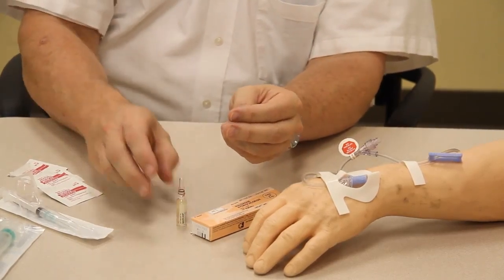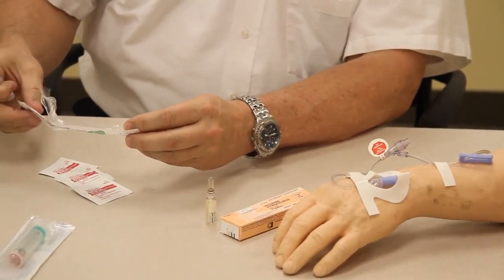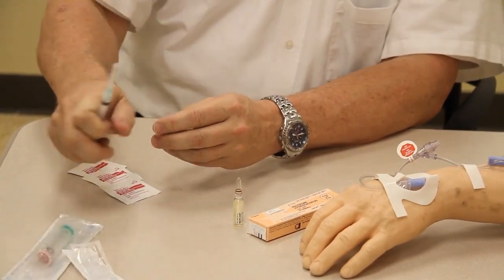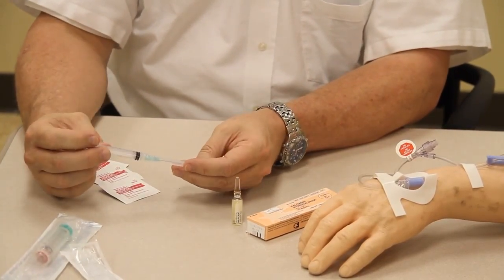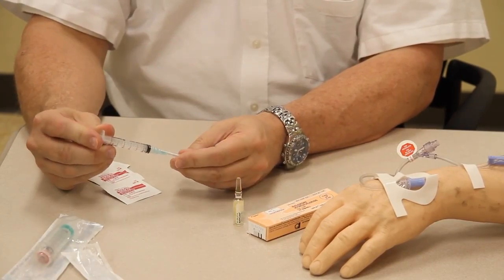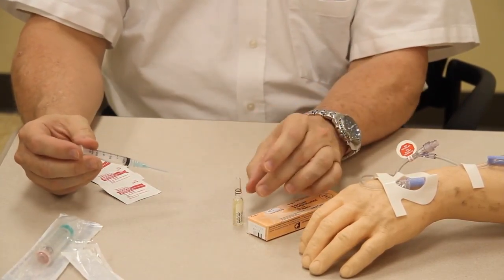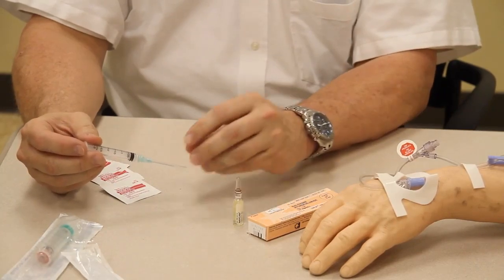After we accomplish that, we want to make sure that we choose the correct syringe. There are 2 milliliters in this, so I've chosen a 3 milliliter syringe with a pretty long needle on it so that I can reach the entire section. I want to make sure that the syringe is long enough so that I can take all the medication out.